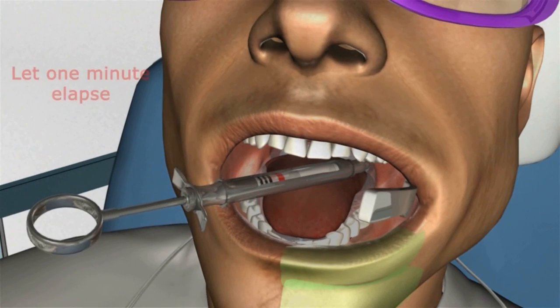It should take between 1 to 2 minutes to deposit a full carpule of anesthetic solution for patient comfort. Thus, it is necessary for you to be comfortably seated. The most likely cause of discomfort for a patient is the speed with which you penetrate the tissue and deposit the solution. Nothing with anesthetic delivery should be done fast.